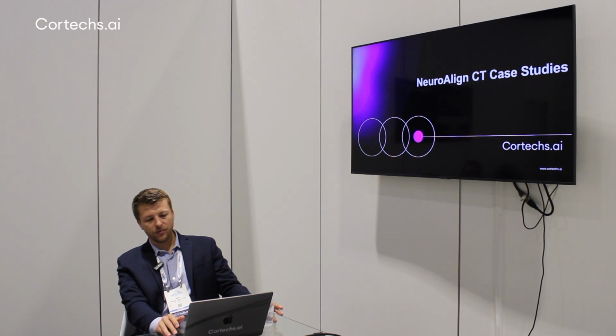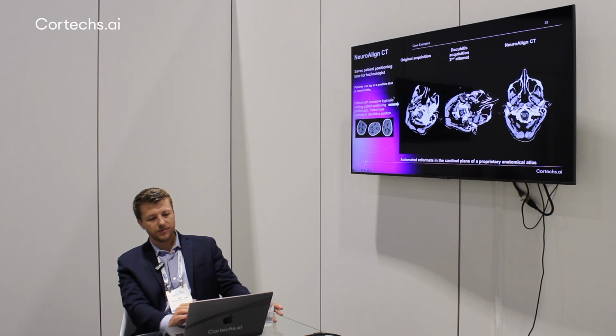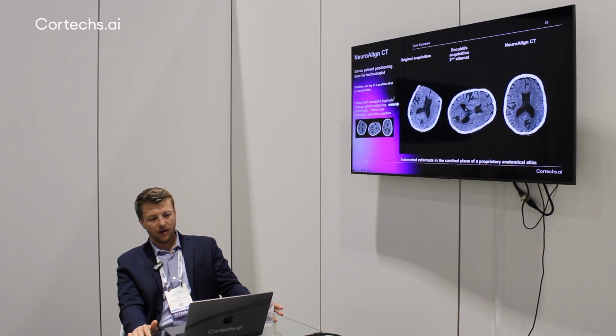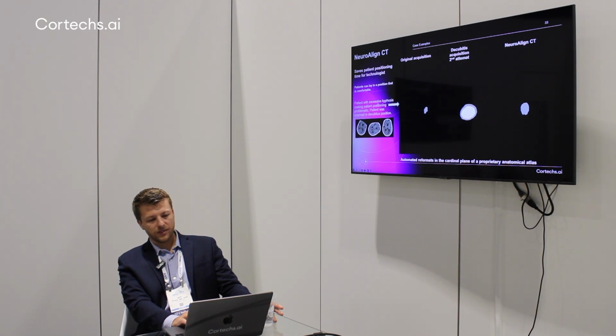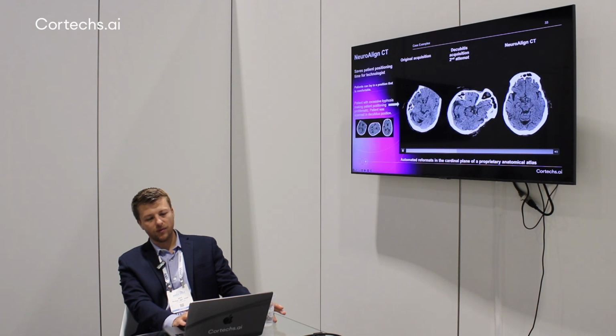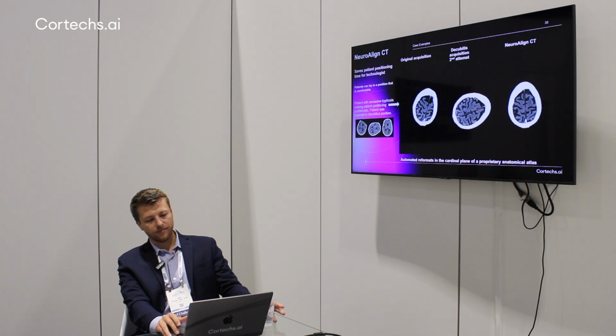Okay, so now I'm just going to go through a bunch of example cases. This is an example of how sometimes it's challenging for patients to lay flat and be in a standard position, to position in the right way. This patient had excessive kyphosis, and they tried 2 times to position the patient, but they were just not able to tolerate it. So that's one of the standard things that it does. It'll realign it, so it's what you expect to see.